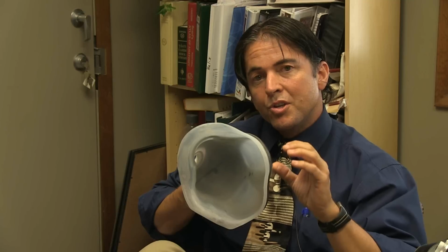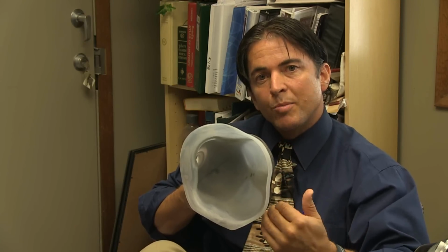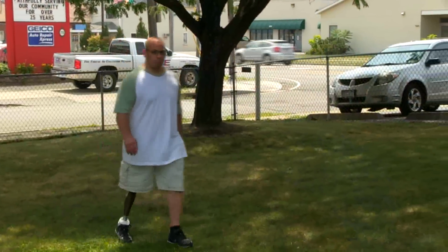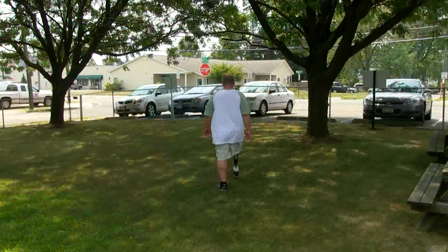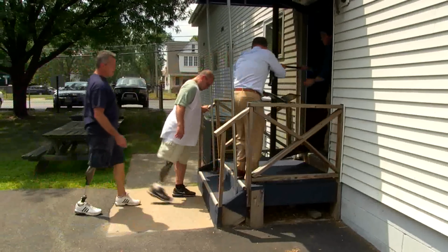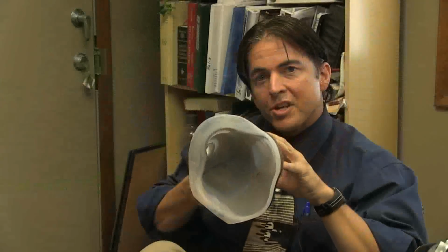And what that allows us to do is get much closer to the bone, such that when the person begins to move their skeleton, the prosthesis instantly responds. And why that's important is that they save a lot more energy when they walk, it feels a lot lighter, and most importantly, it feels like it's a part of them. It captures their skeletal motion very efficiently, and it's extremely comfortable.